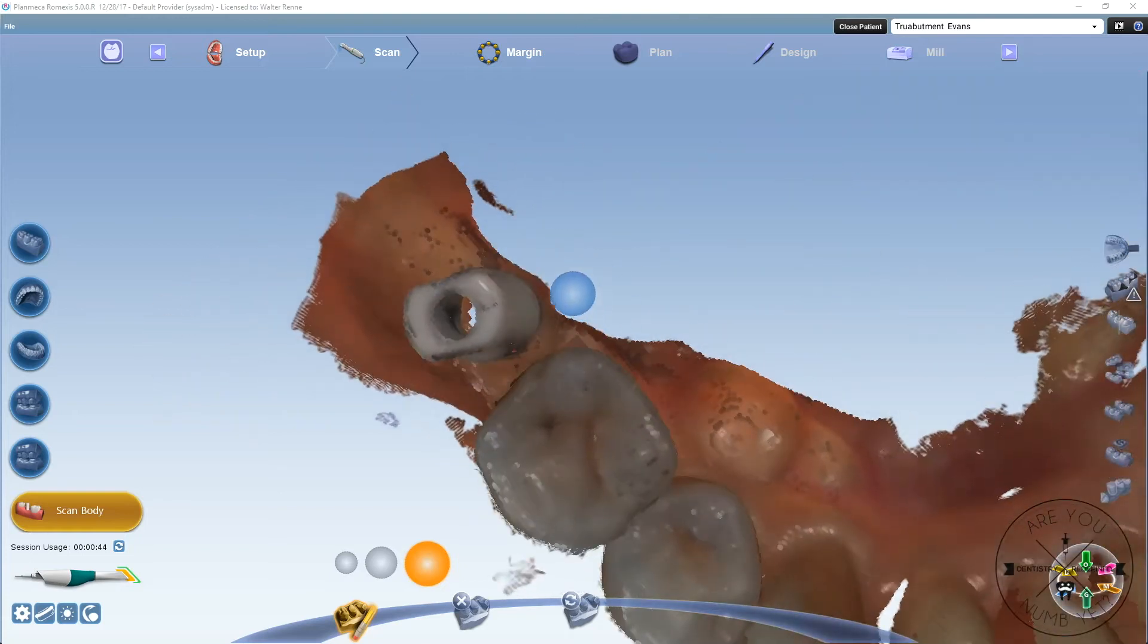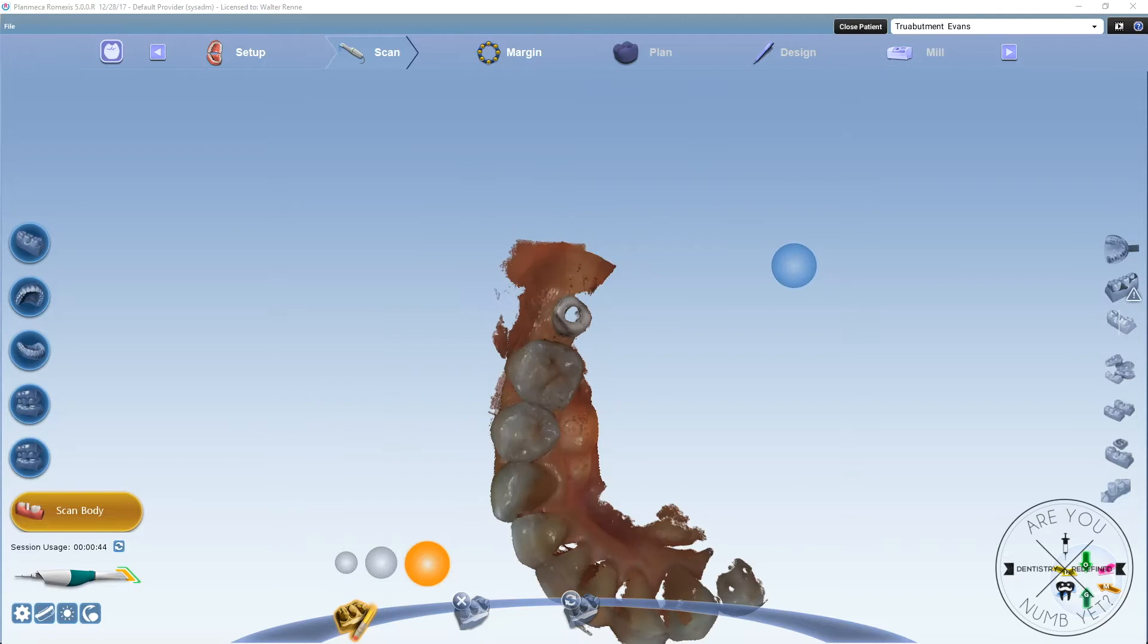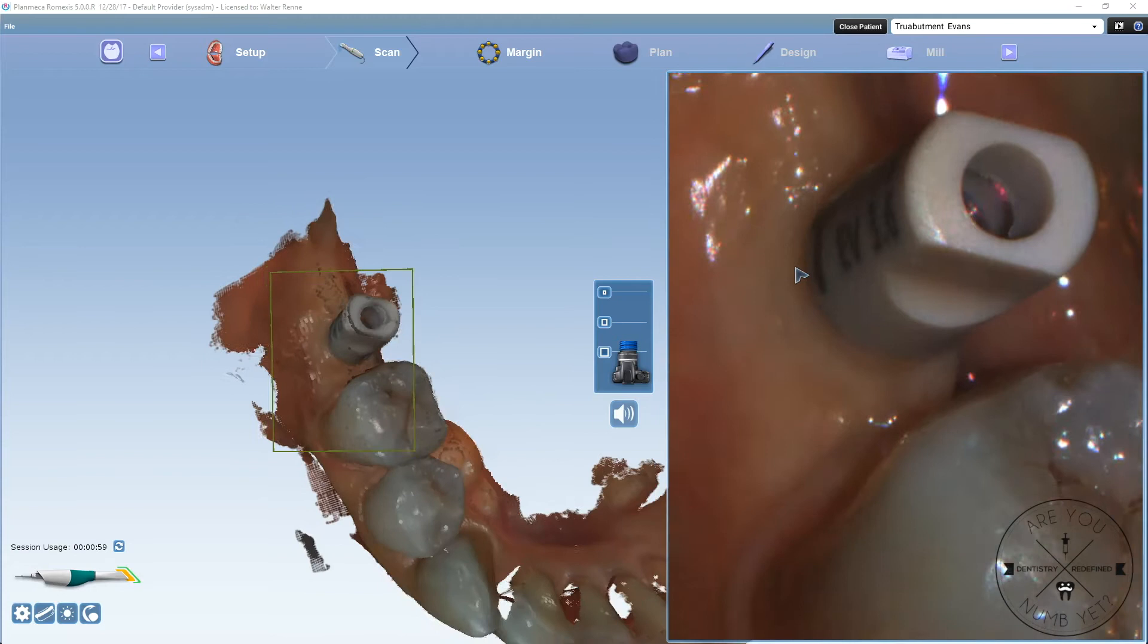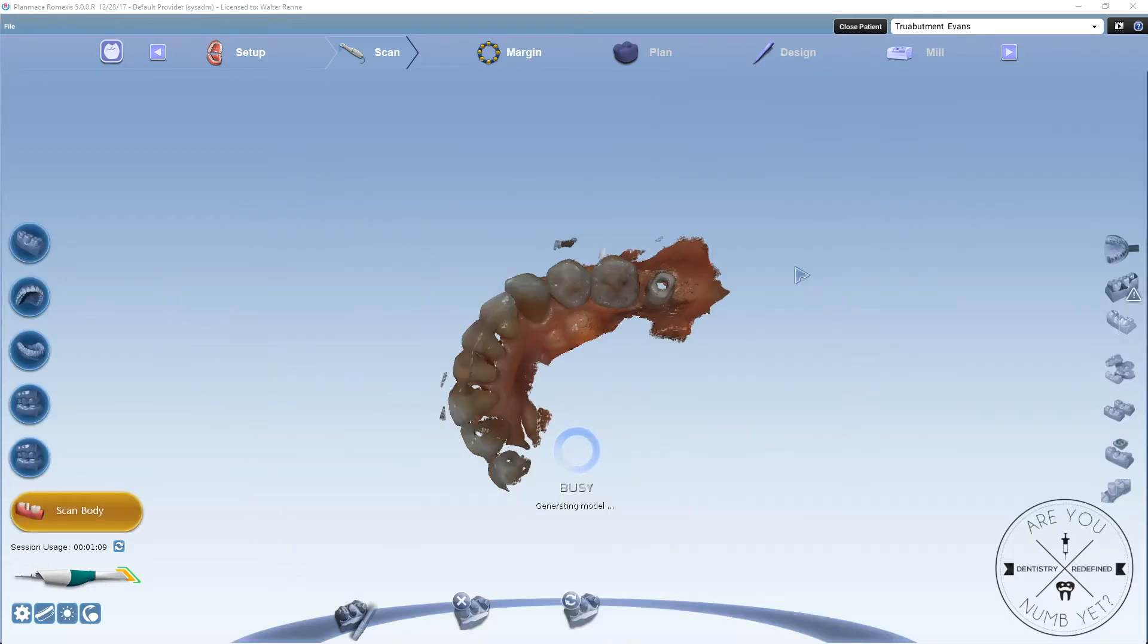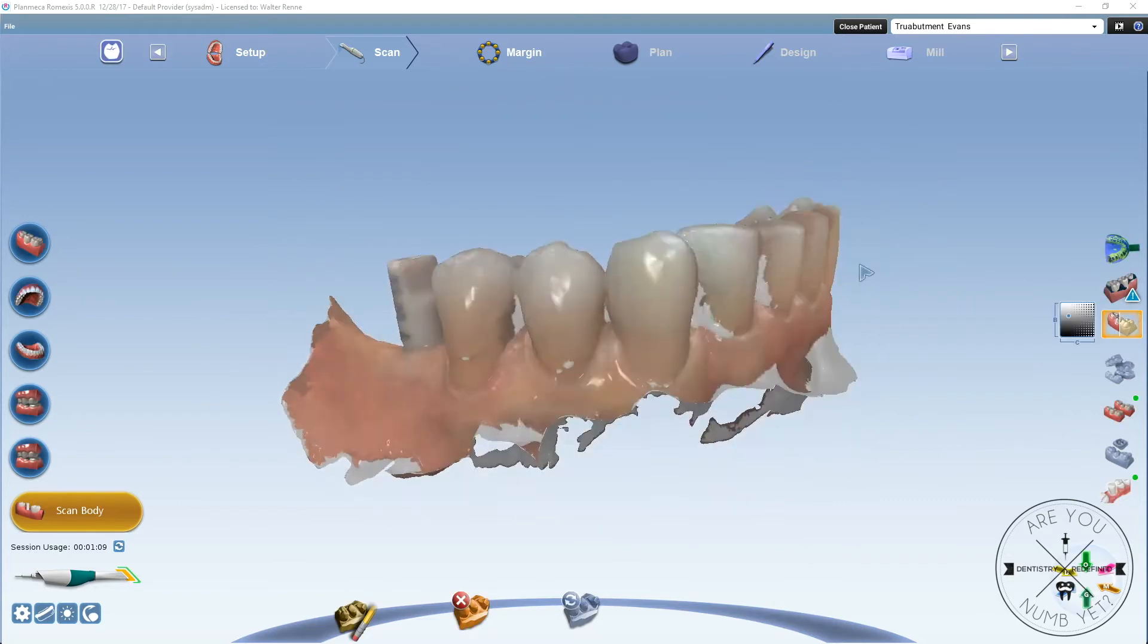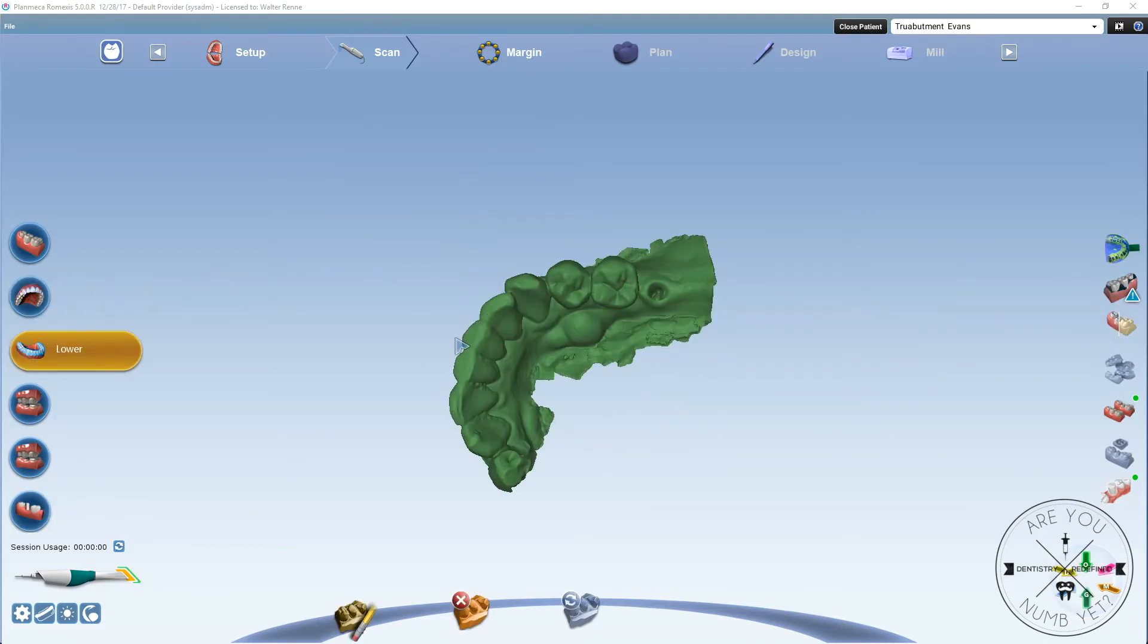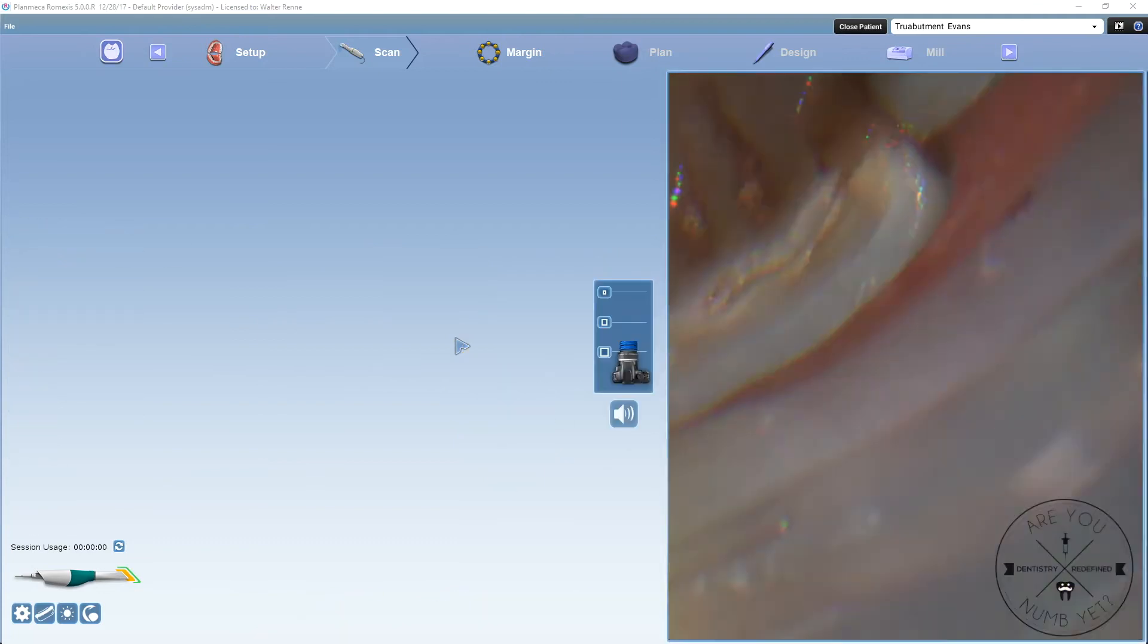You have to rotate it and be pretty critical of yourself. Like in this instance, the tongue came over that area. I could have used active delete, but I'm just going to erase that little spot and fill in that area, making sure that flat surface you see right there is the most critical area to capture. That's going to help the lab align the DCM file of the scan body to the actual digital model for implant location. So it's really important to capture those surfaces.